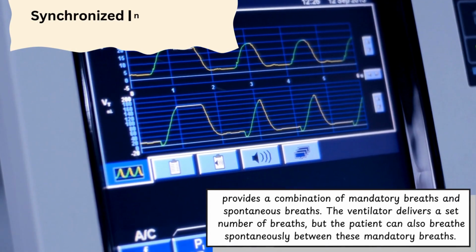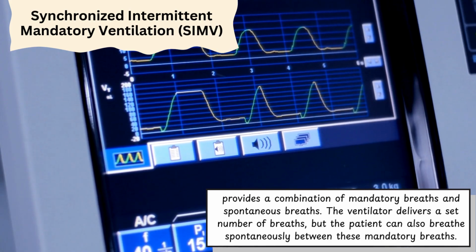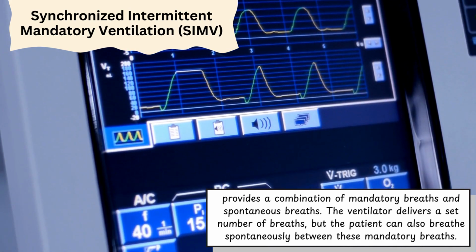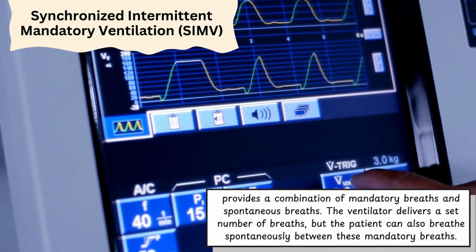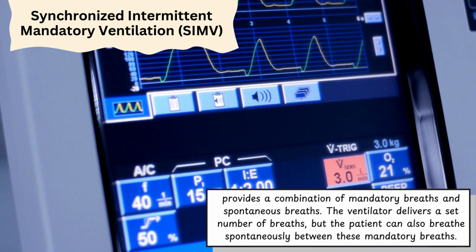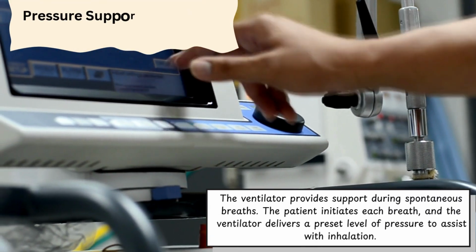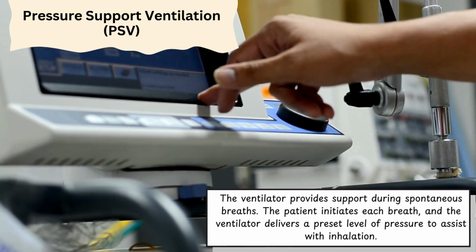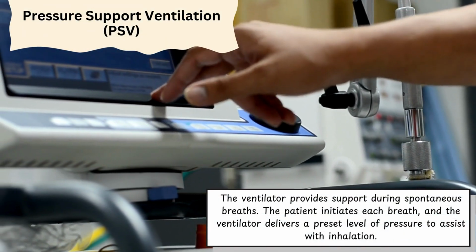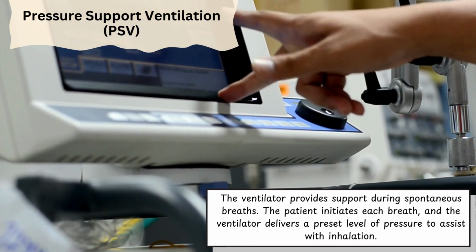Synchronized intermittent mandatory ventilation, SIMV. This mode provides a combination of mandatory breaths and spontaneous breaths. The ventilator delivers a set number of breaths, but the patient can also breathe spontaneously between these mandatory breaths. Pressure support ventilation, PSV. In this mode, the ventilator provides support during spontaneous breaths. The patient initiates each breath, and the ventilator delivers a preset level of pressure to assist with inhalation.